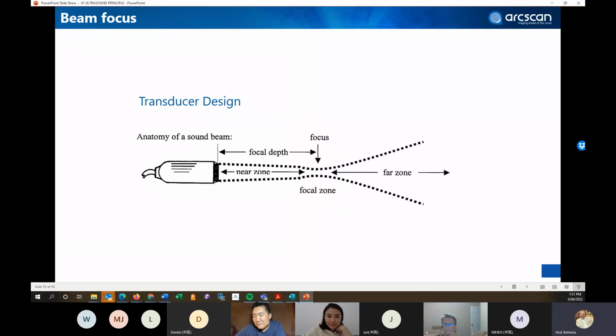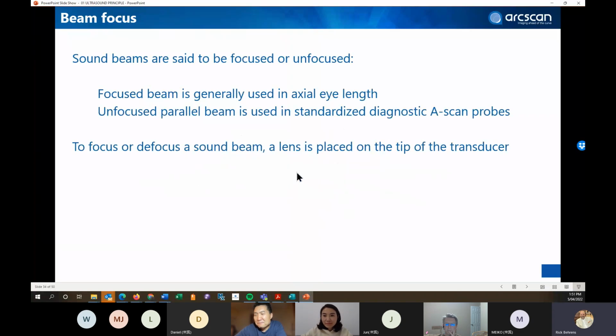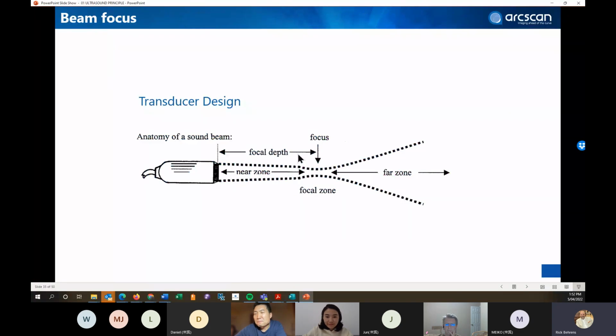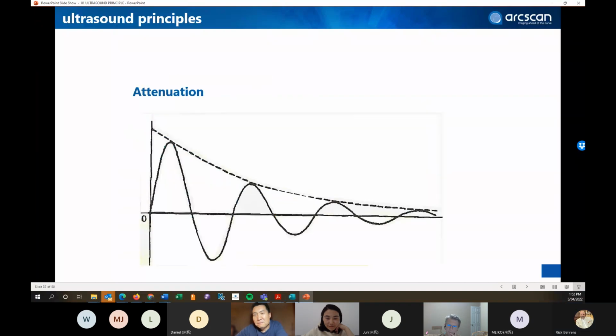When you are evaluating an eye for ICLs, you need to place the iris plane as close as possible to that red line. Because if you don't, the image will not be at its best position. Every transducer has a focus zone, which gives the best resolution, and it is indicated on the screen by a red line when you take the image.